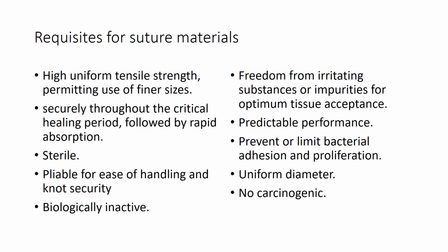So let's look at suture material. What are the requisites for suture material? The requisites are: the material should have high uniform tensile strength and should permit use of finer size. The material also should be secure throughout the critical healing period, followed by rapid absorption.